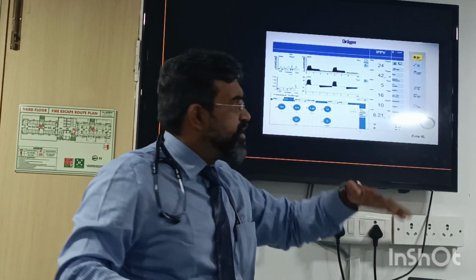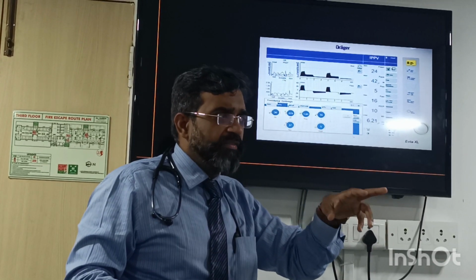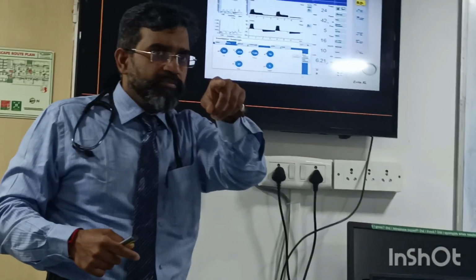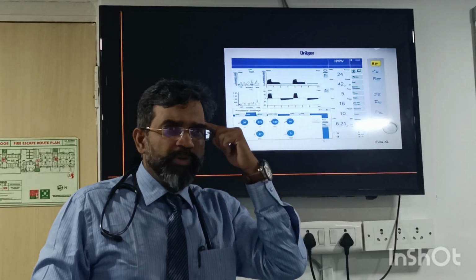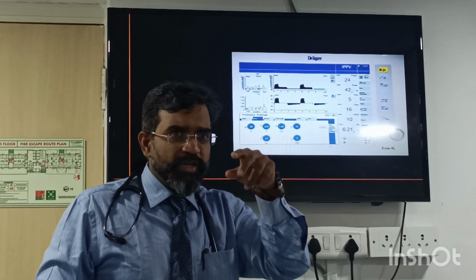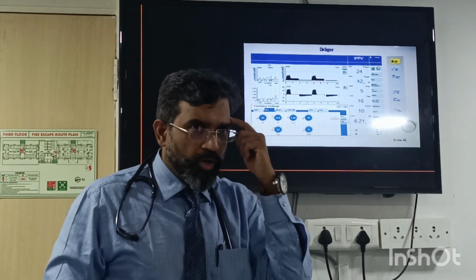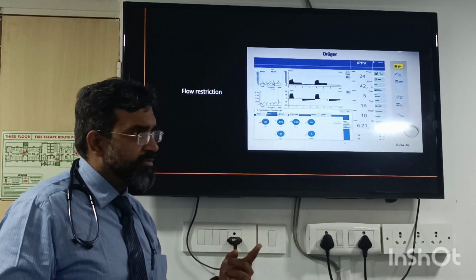So that is why in these cases, when you see excessive flow restriction and the BP is dropping, the first thing you do is disconnect the ventilator or change the mode, which you should have done last time. You had called me saying, sir, BP drop. Your thinking should have been, am I reducing my venous return? Which you were. We changed the mode and the BP came up. You should have thought like that. Flow restriction. Clear on this?